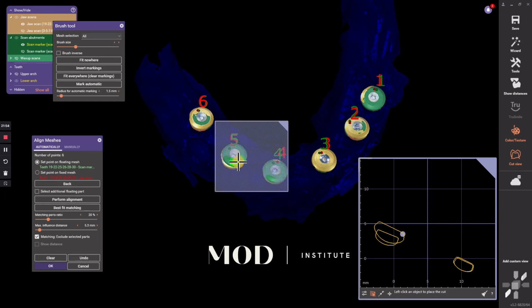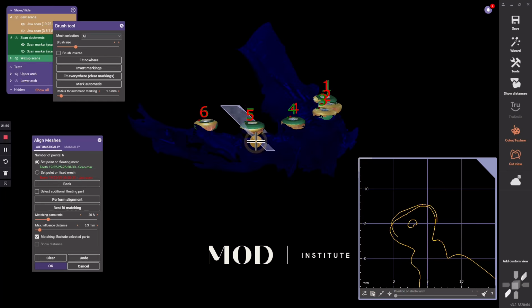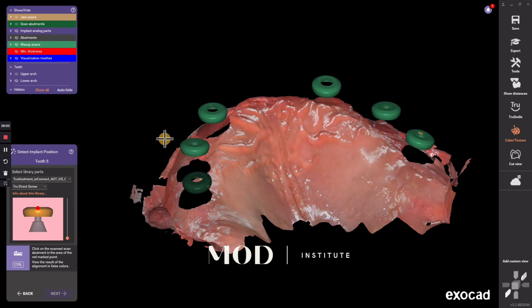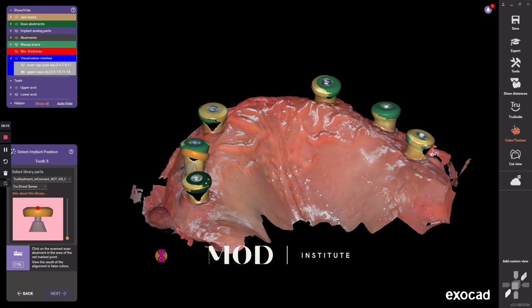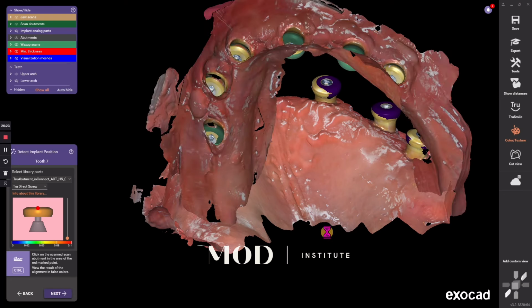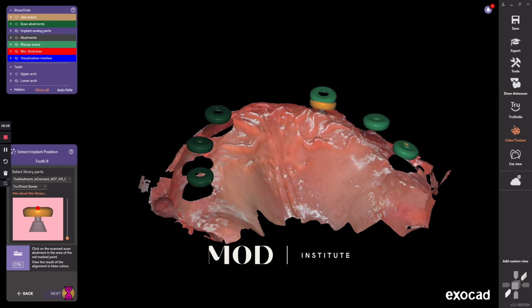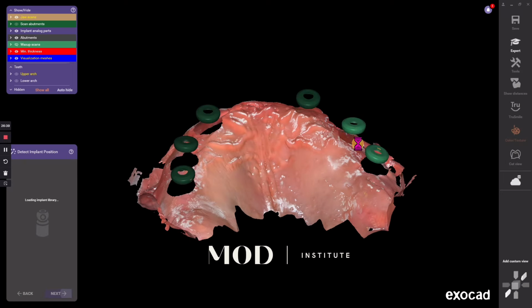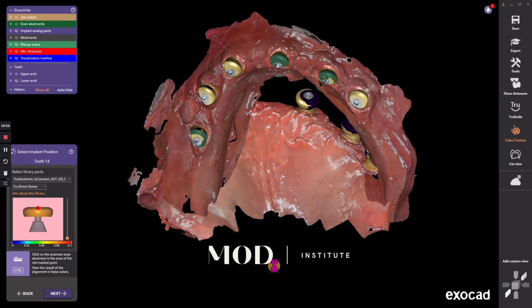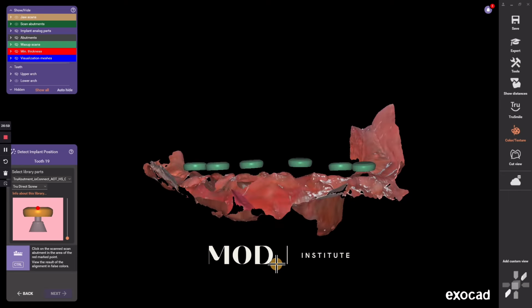Showing that we have, and let's just go ahead and slice it and measure it, we have like a few hundred microns discrepancy there, but that would cause lack of passive fit. So then we merge the top, and then we go through just the merging of the scan bodies, and now ExoCAD is using the exported ioConnect caps as the implant locations, not your soft tissue scan. That was really just to align to the tissue for your tissue pressure and stuff like that, and your occlusion. It's not really for implant locations. The intraoral scan of the soft tissue is just for soft tissue.